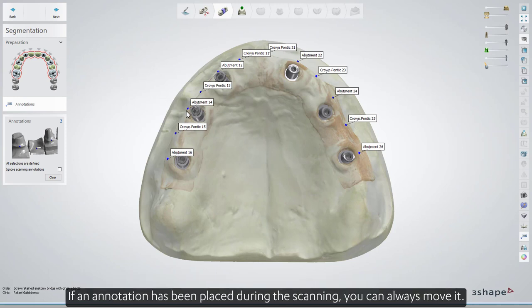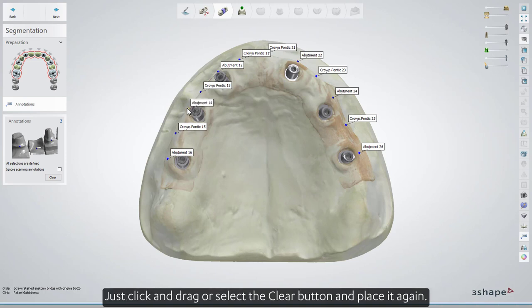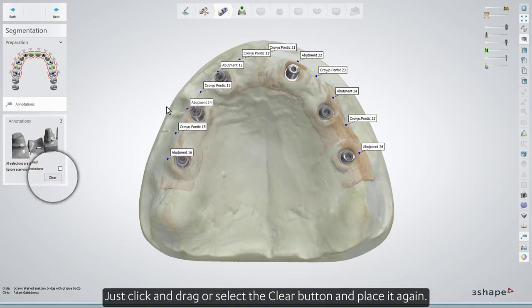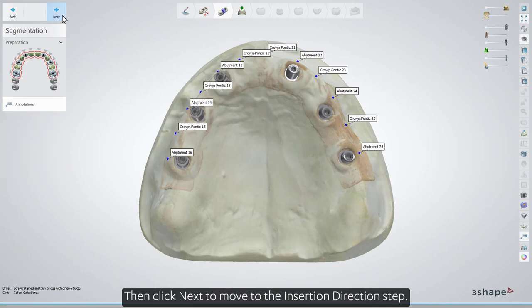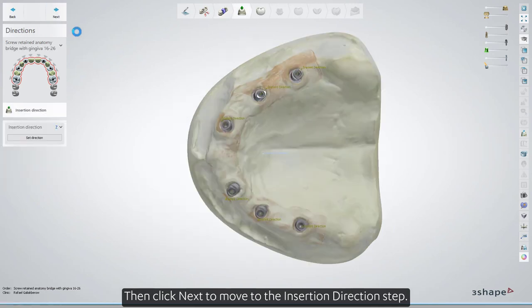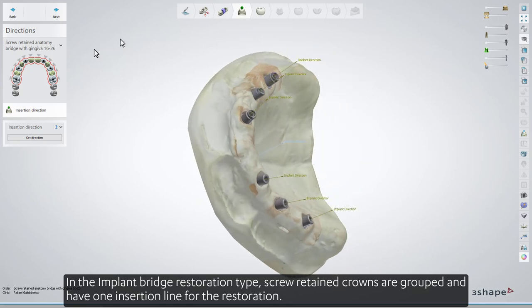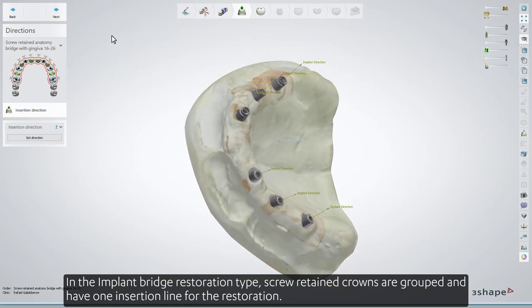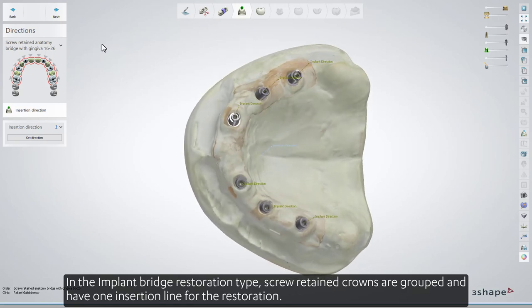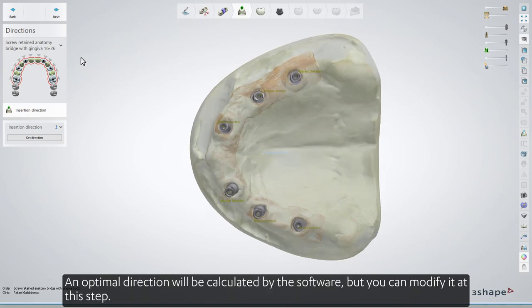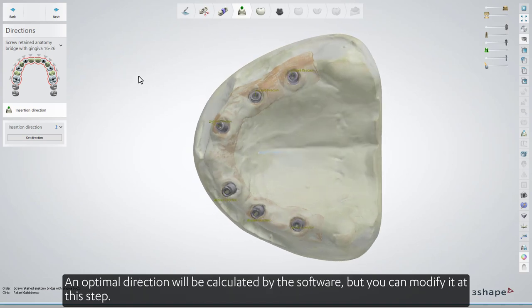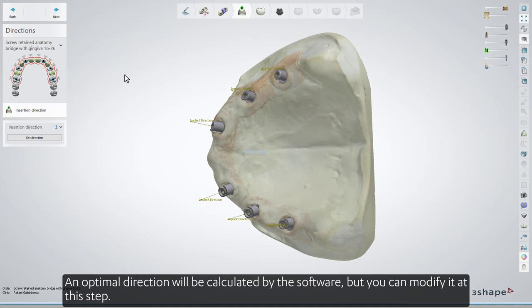If an annotation has been placed during the scanning, you can always move it — just click and drag, or select the Clear button and place it again. Then click Next to move to the Insertion Direction step. In the implant bridge restoration type, screw retained crowns are grouped and have one insertion line for the restoration. An optimal direction will be calculated by the software, but you can modify it at this step.